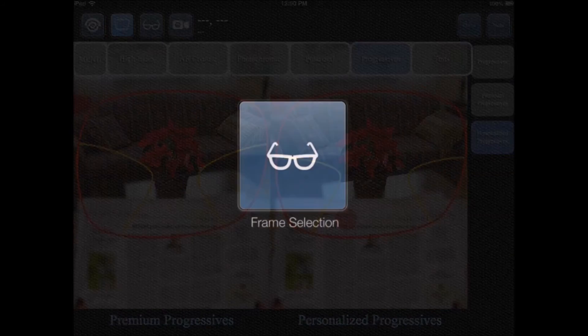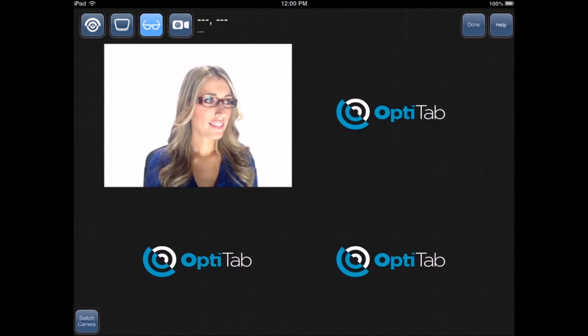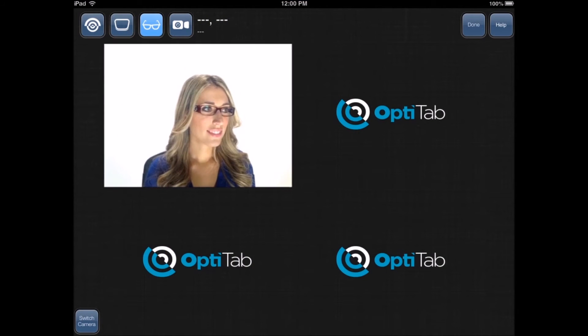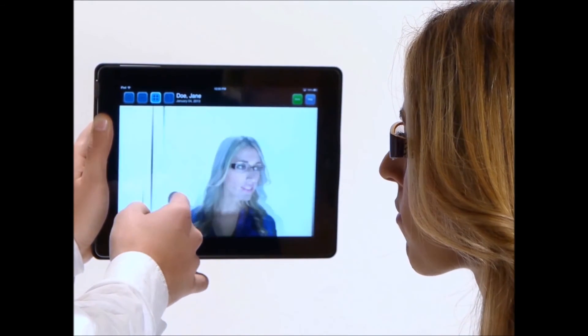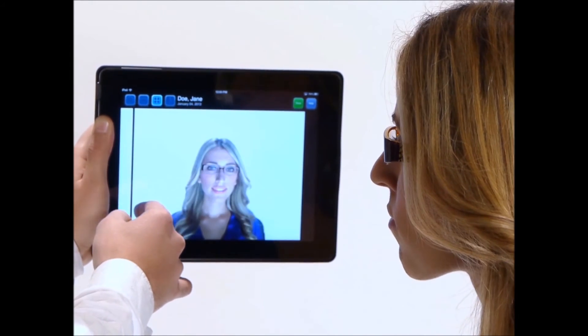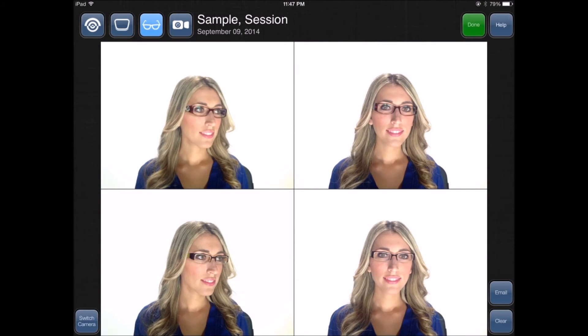The frame selection module enables customers to see how they look in different eyewear. The side-by-side image comparison exposes the customer to frames of different styles, resulting in an increase in multiple-frame sales. You can email customers their pictures by touching the email button located at the bottom-right-hand side of the screen.